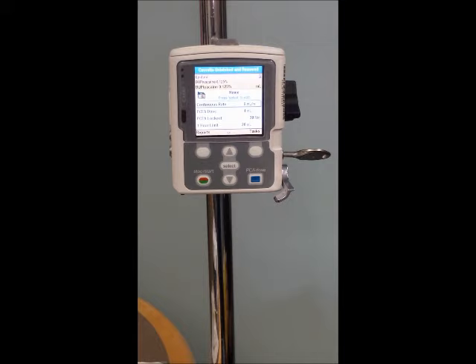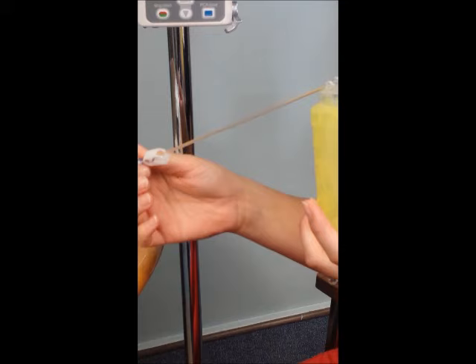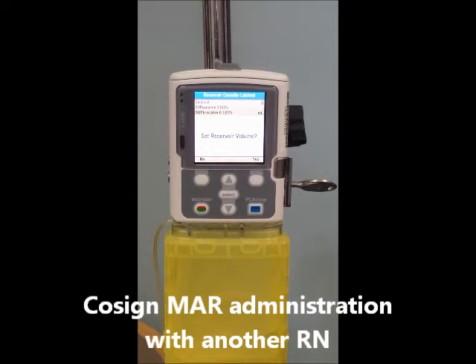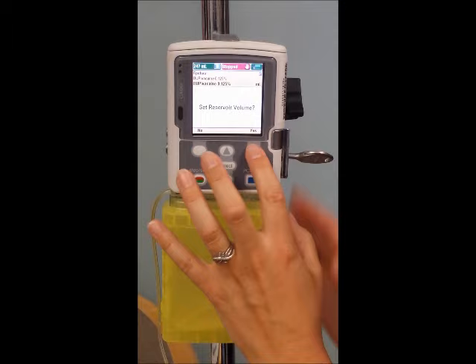You'll take your new cassette, which has been filled by pharmacy — the pigtail will be primed already for you. Clip the cassette on to the bottom of the case, raise the lever back toward the pump. You're going to get an indication asking you if you'd like to set the reservoir volume. You're going to confirm yes and hit yes.